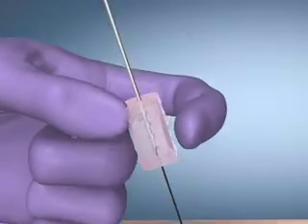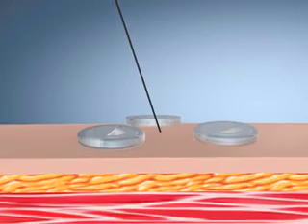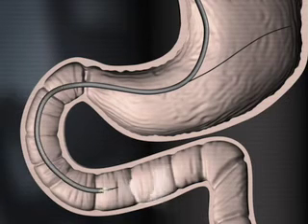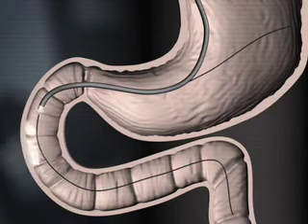Slide the introducer needle safety collar down the needle shaft while removing the needle to prevent inadvertent needle stick. Using endoscopic visualization, grasp the guide wire with an atraumatic forceps and advance the guide wire through the pylorus into the proximal jejunum, 10 to 15 centimeters beyond the ligament of Treitz.